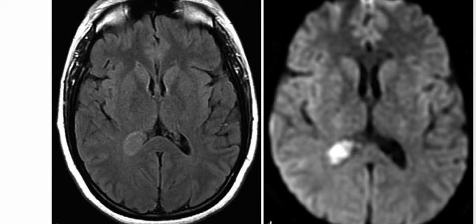So this is the lesion, a subtle cystic lesion which is located in the atria of the right lateral ventricle. So considering this key imaging finding of a cystic lesion in the ventricle, that is a ventricular cyst, the top differential should be choroid plexus cyst. However, you can add ependymal cyst in the differential along with arachnoid cyst and choroid plexus xanthogranuloma.